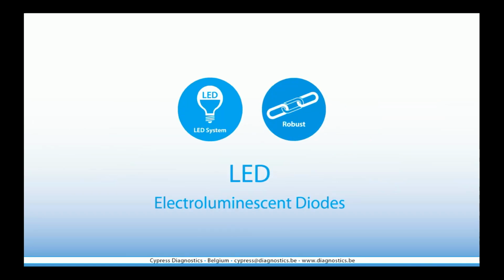And then we have the LED technology. The LED technology stands for electroluminescence diodes. What does it actually mean? It means that normally when you have a lamp and you put on the instrument, there is a certain level of intensity when it starts. Then the light intensity goes down after a period of time, and at a certain moment, you need to replace the lamp as the intensity of the light is not big enough to give good results.